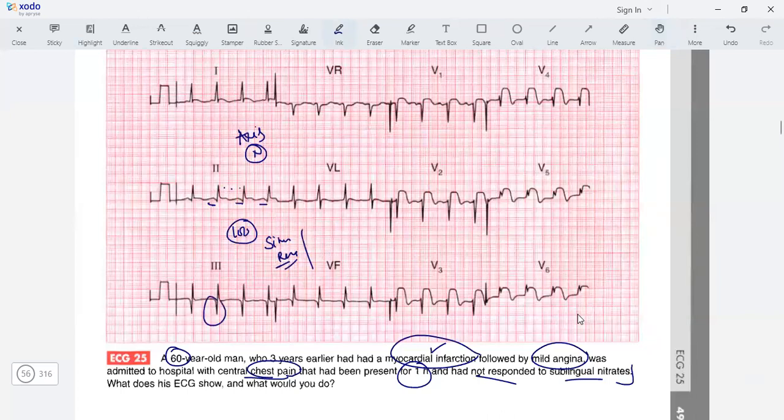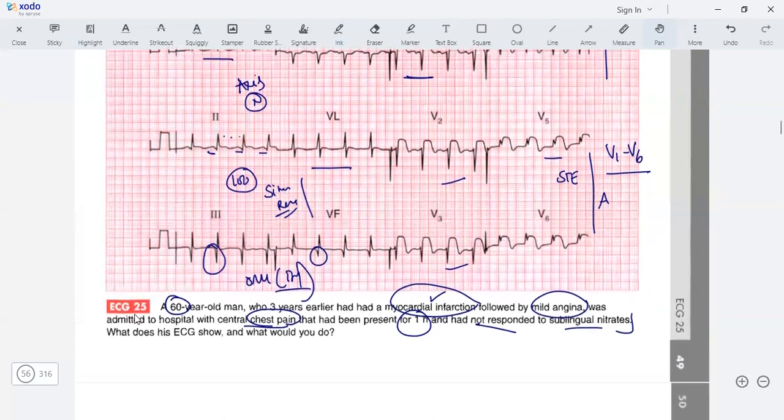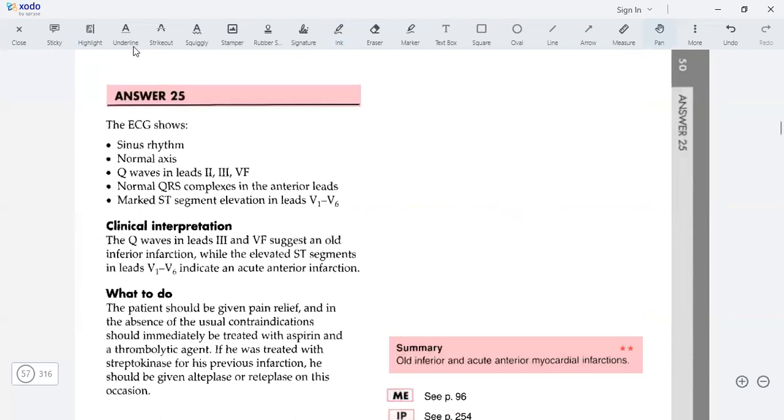The axis is normal. Looking at 2, 3, AVF - there's some Q in lead 2, but the Q is more prominent in 3 and AVF, could be an old inferior MI. Lead 1 shows flattening of the T wave. V5 V6 have definite ST elevation. ST elevation is present from V1 to V6 - definite ST elevation all through V1 through V6. This is a STEMI. There's some Q in V1. This is acute STEMI involving the anterior and also some lateral area. This is extensive anterior STEMI. The patient needs to go through a STEMI protocol.